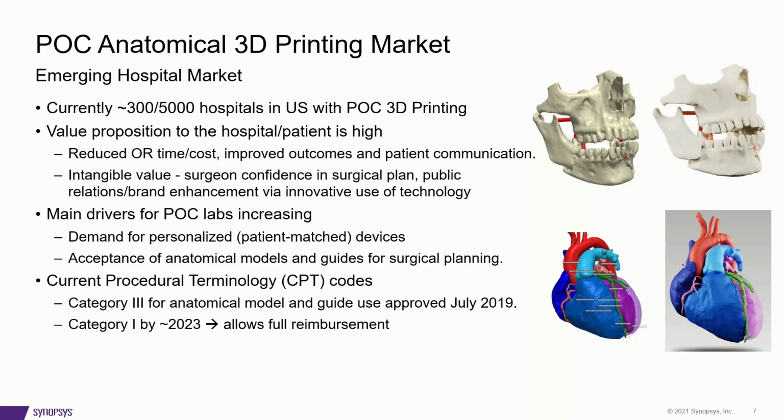And then there are some intangible values, things like surgeon confidence in the surgical plan, public relations, brand enhancement via innovative use of technology, showing that you're using some new technologies to help patients in these uncertain times. It can be pretty scary going into these very complex and large surgeries, and it gives patients a lot of confidence to have an actual physical, tangible model of, say, their organ or different part that's going to be undergoing this procedure.